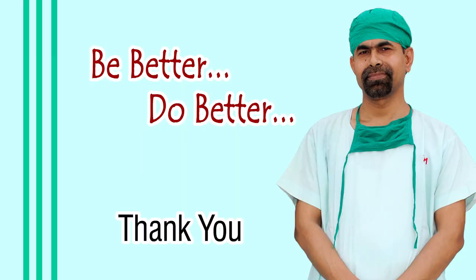The case is concluded. Thank you very much for your attention. I hope this video will help you develop your surgical skills. Be inspired to use the pre-chopper in soft cataracts where it is difficult to hold the nucleus. There are other ways — you can prolapse the nucleus out of the bag — but if the rhexis is small it becomes difficult, and this pre-chopper helps a lot. I have no financial interest; I am sharing this just to make you more competent and more equipped.